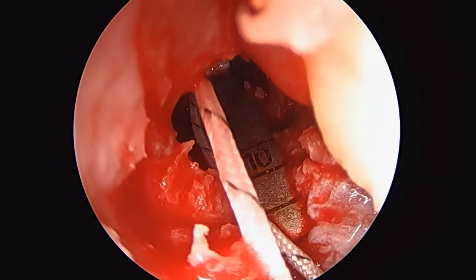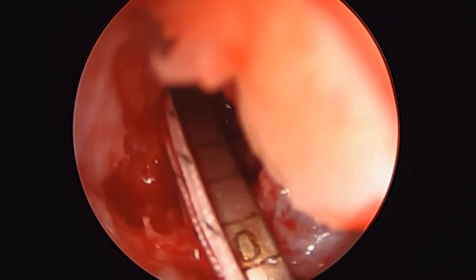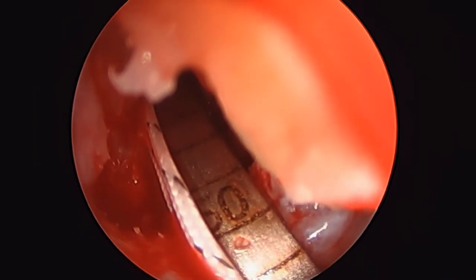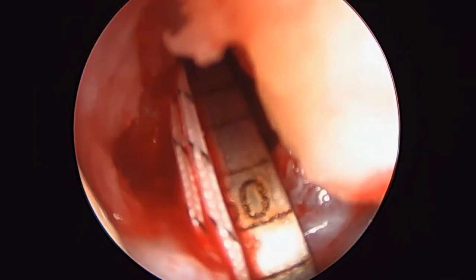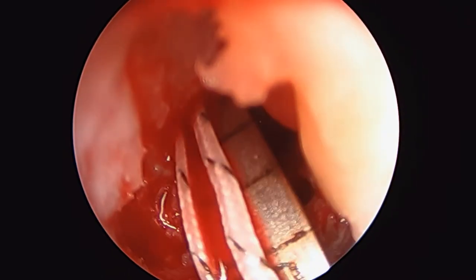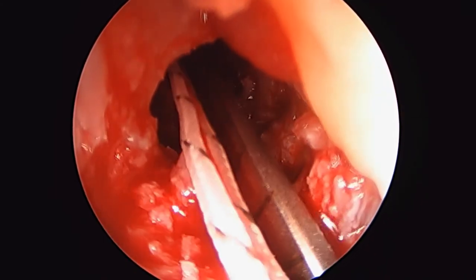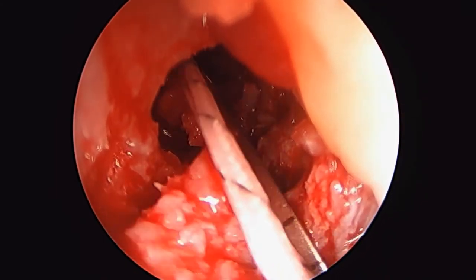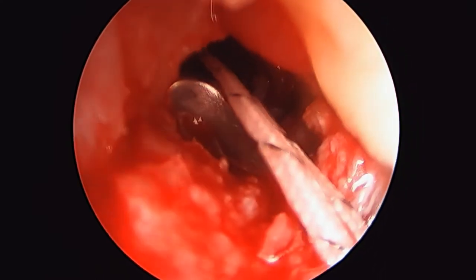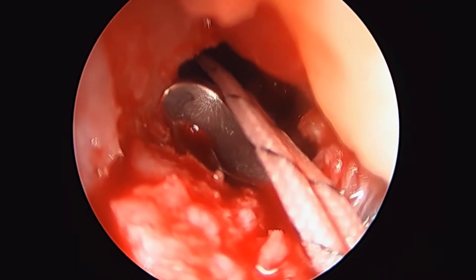I just want to show you how we make our measurements. This ruler goes up into one of the tunnels and it's the line above the number — so there's 50. They go by two millimeter increments, so that's 48, 46, and really it's right at 44. Then next we'll measure the length from here, and we need a metal ruler for that.